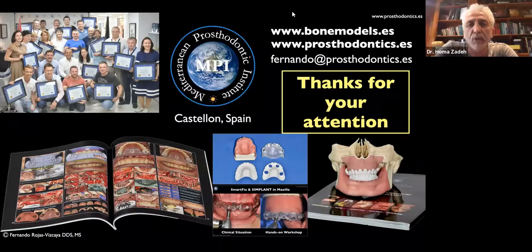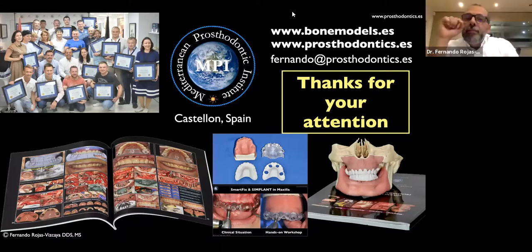So my other question is about the verification jig that you produce digitally. Do you have to section that later and lute them intraorally, or it's not necessary? Because between the titan base and the verification device that you create, you have like a micro gap. You have a tolerance. And the reason is because I am not sure if doing the intraoral scanner impression, if the accuracy is 100%, probably yes or probably no, but I don't want to take the risk.